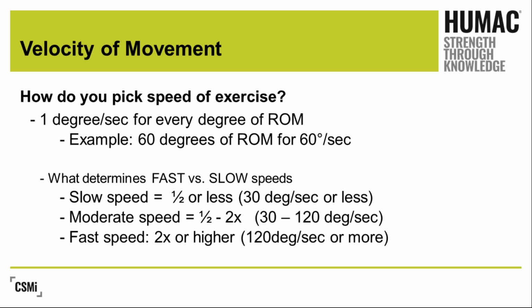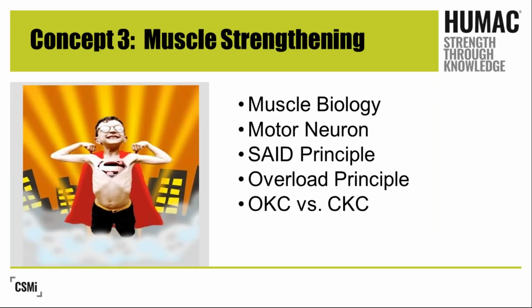I am not going to tell you that high-speed exercises are appropriate for everyone. In fact, what I'm going to tell you is that most of our patients start with slow to moderate speeds, and only our higher-end rehabilitation patients go on to fast-speed deceleration training techniques that we're going to get into. So we're going to go into this subject very aggressively in the future.